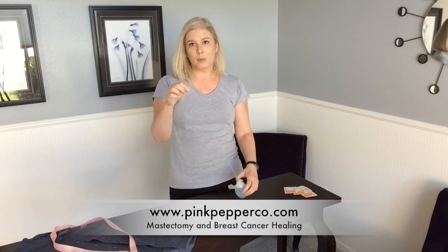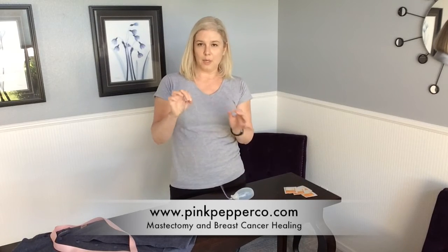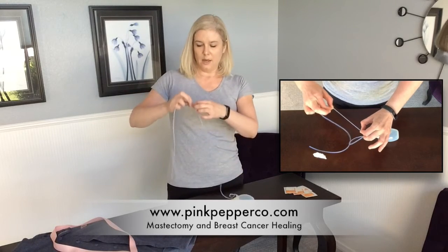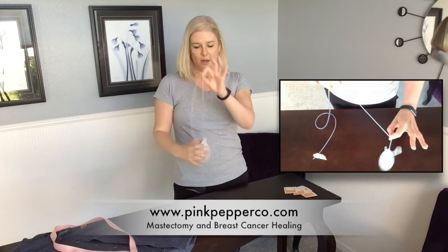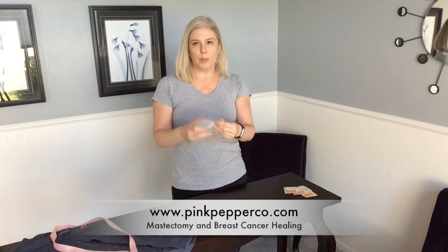One thing they probably will ask you to do is strip the line, and that basically means you're going to clamp it off with your fingers, the tubing here. It'll again be attached somewhere here, and then you're going to pull it like this real tight, and you're pushing all the fluid into the bulb end. You're going to do that usually before you drain it. Then you're going to open it and drain it.